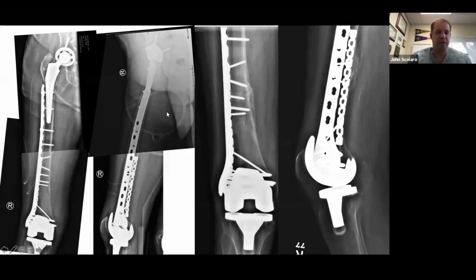Two things I want to comment on. One, with these patients who have had total knee prosthesis in place, they get a lot of lateral and medial condylar hypertrophy, and so that will actually push the plate or create even more of a deformity, especially if that plate sits a little bit more posterior. I don't know if they get stress shielding or whatever, but the condyles hypertrophy a little bit more proximally, which can affect implant placement.